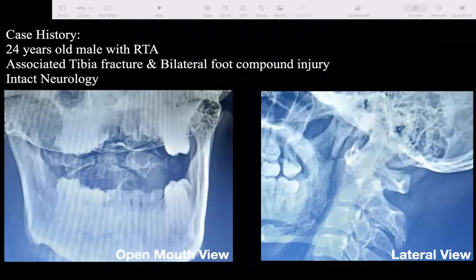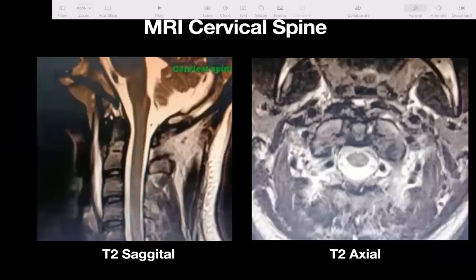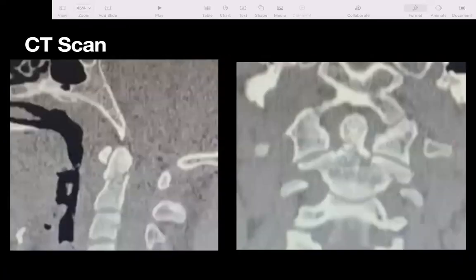This is a 24-year-old male who sustained an injury in a road traffic accident. His neurology was intact. On open mouth view, the C1-C2 joint was congruent and the odontoid was anteriorly displaced. There was no spinal cord injury, and on axial MRI cuts, the ligaments — especially the transverse ligament — appeared intact, with some comminution at the fracture site.